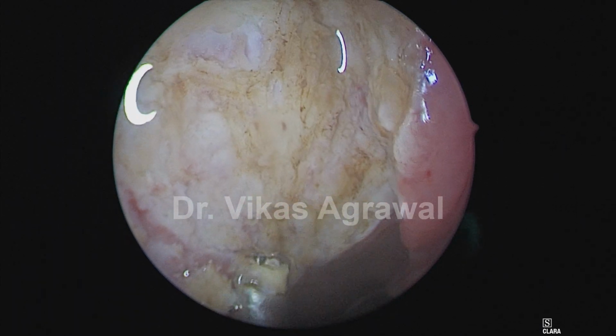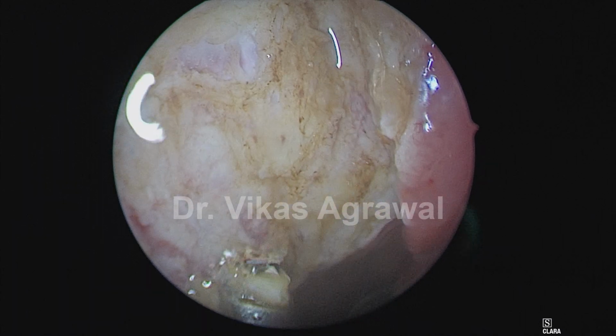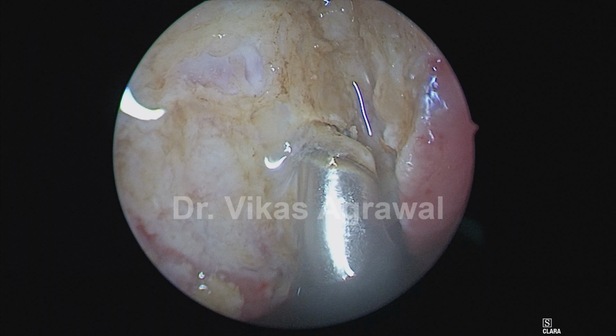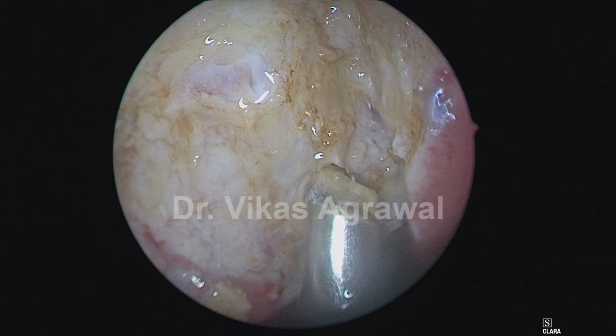Now, whatever tissue is left here, I'll just remove it layer by layer like a paintbrush without opening up the fascia, buccopharyngeal fascia.